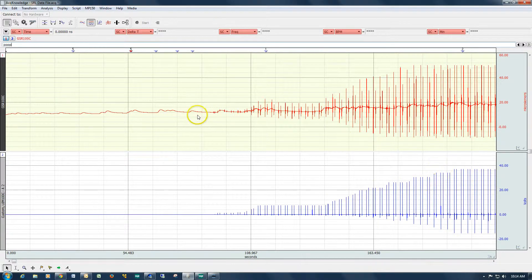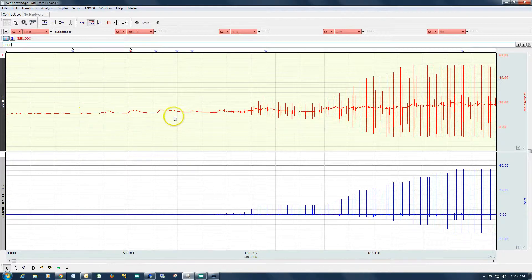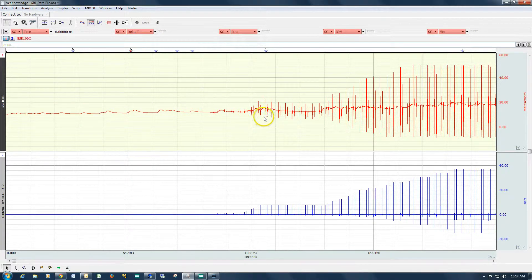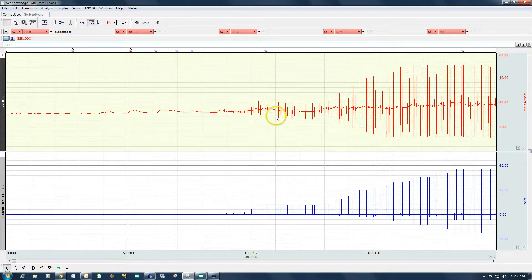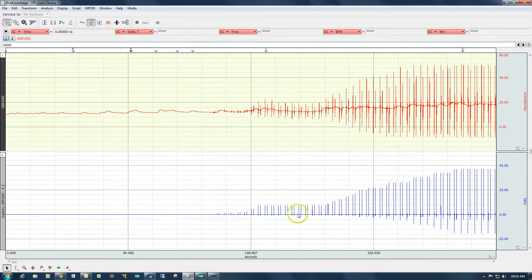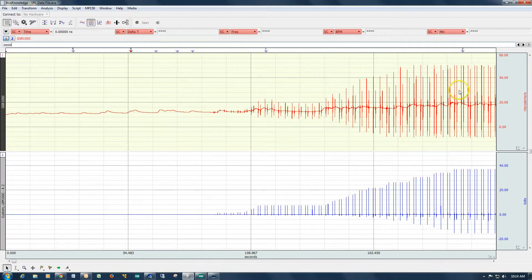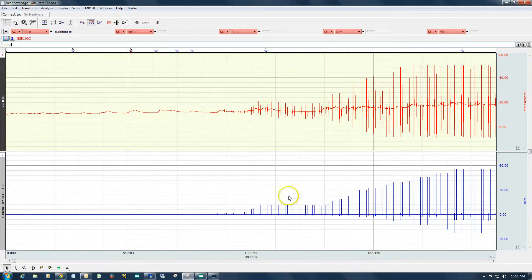And then over on the electrodermal channel, the subject had the electrodes on their fingers recording the electrodermal activity. The electrodes were picking up this electrical signal as it was delivered to the subject. And you can see the artifact mimicking the electrical stimulation as it was presented.